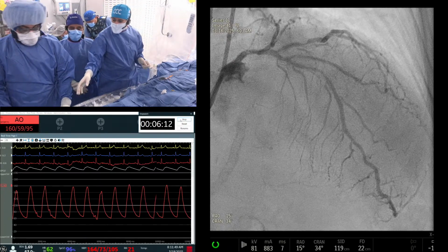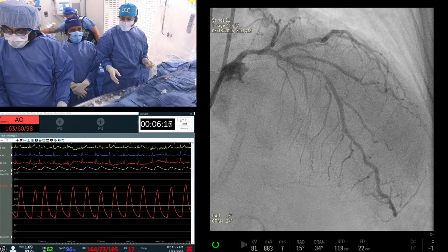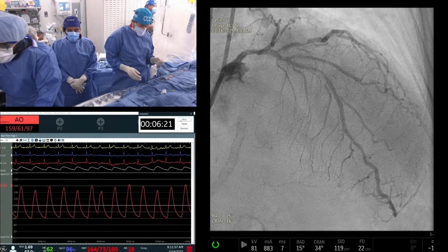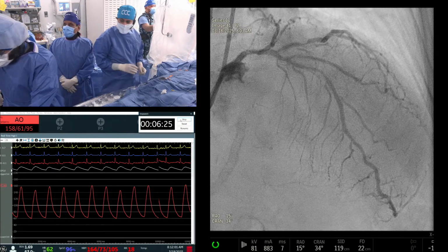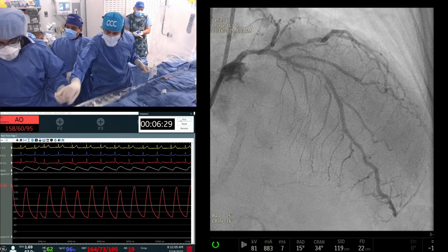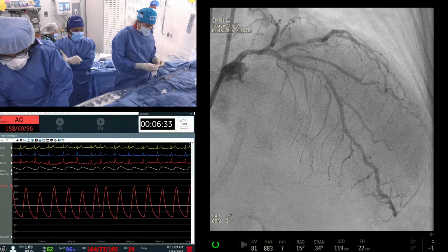And as you know, there's a lot of work being done in the IVL space, particularly laser IVL. The other one is forward-looking IVL for CTO. They're already starting the trial in the peripheries, and some coronary, where they go into the CTO and then use IVL to make the channel into the CTO area.